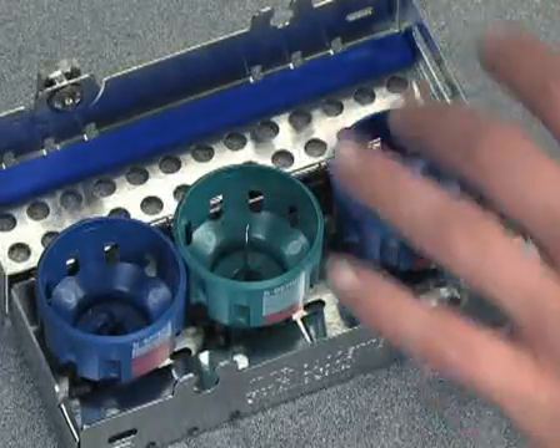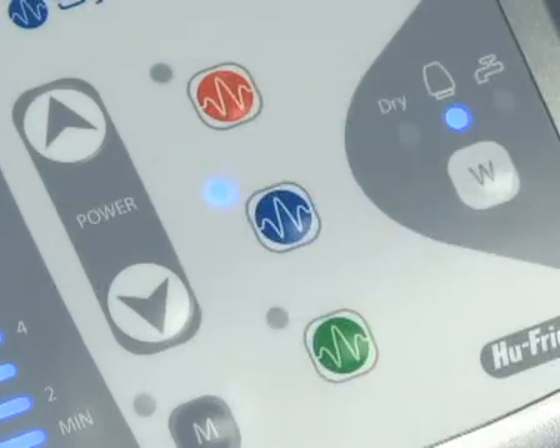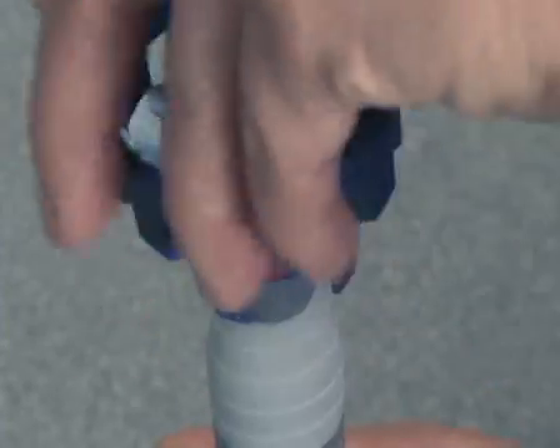The color of the Guardian wrench indicates the appropriate power mode on the Symmetry IQ unit. For instance, select blue mode for Symmetry tips and a blue Guardian wrench.